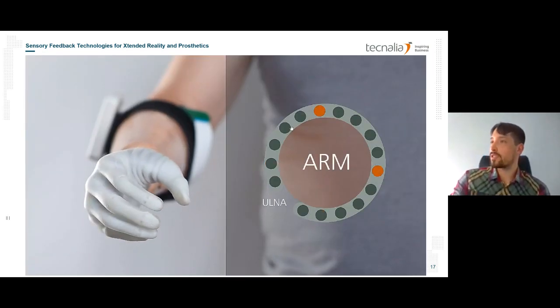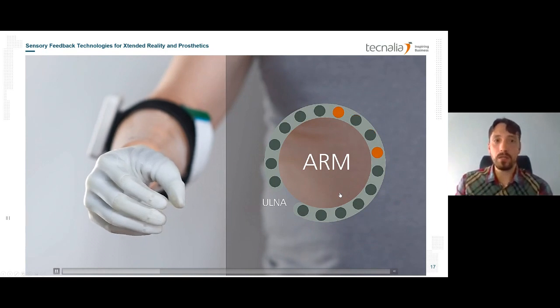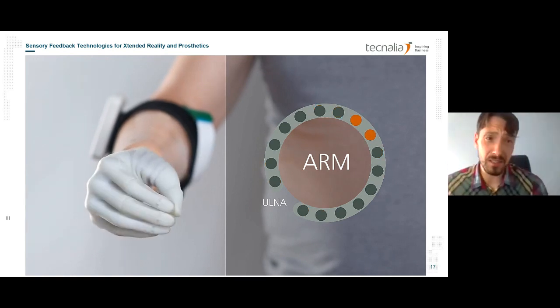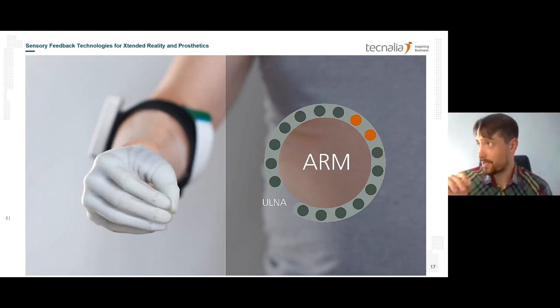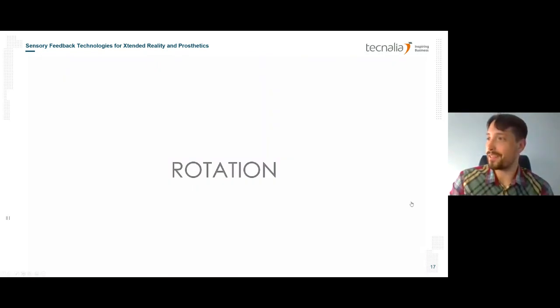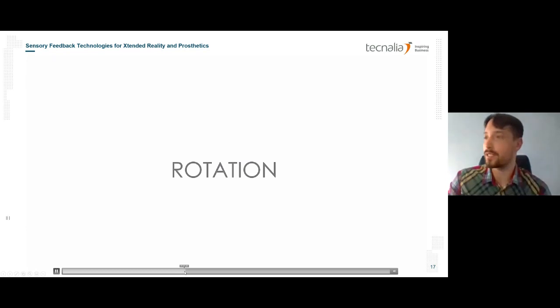This is our electrode inside of the prosthesis socket. I hope that the video now works and that there are no delays, because in the video there are these things being lit up and turned off that are explaining what is happening.